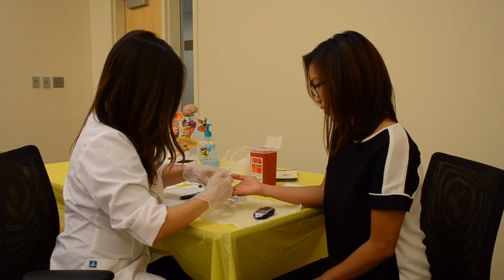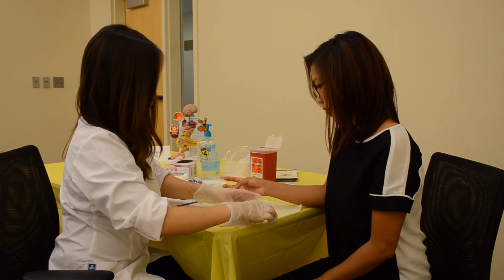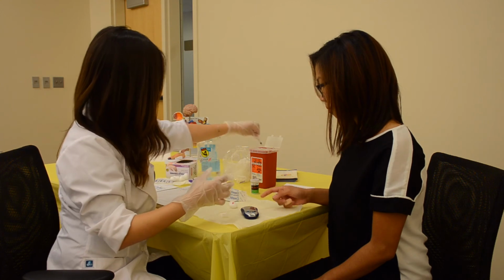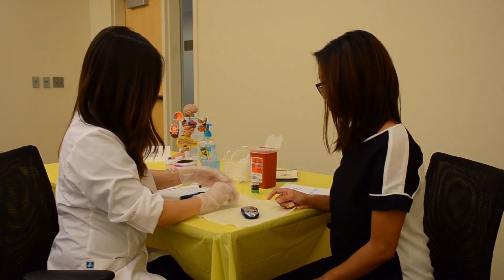The lancet and any items that are soiled with blood are to be put in the sharps container. Everything else can go in regular trash, including the test strip and cotton balls and other items that have small amounts of blood on them.